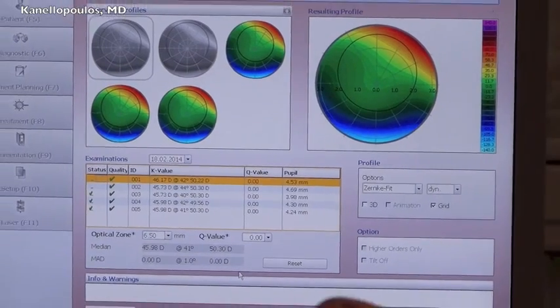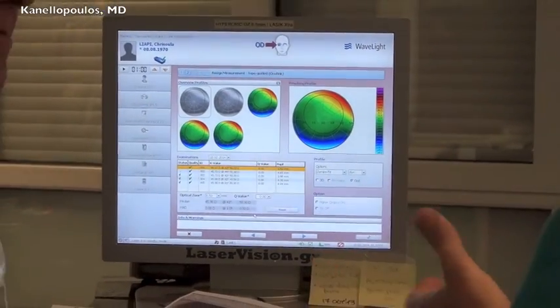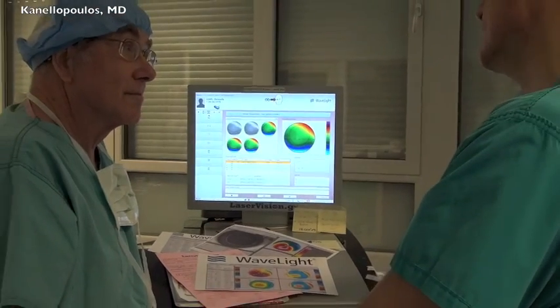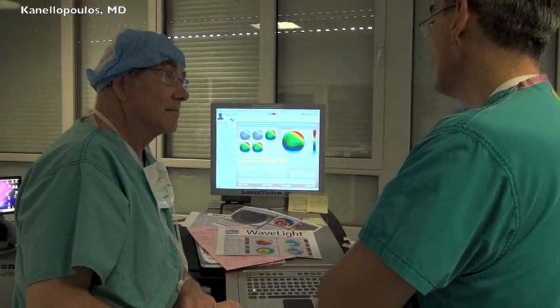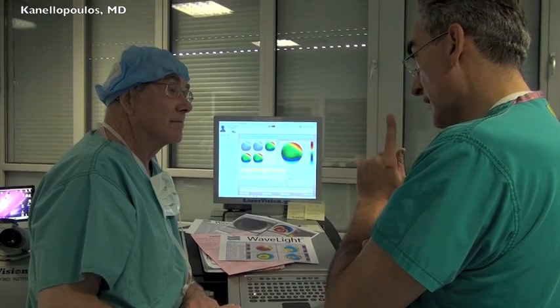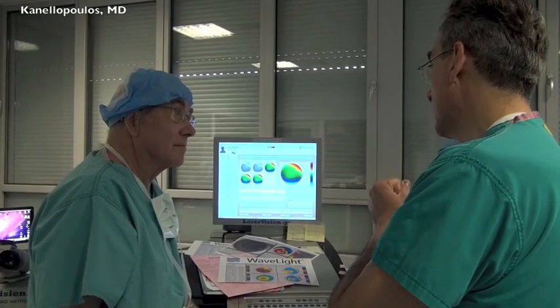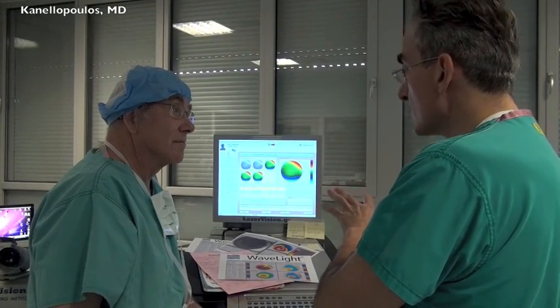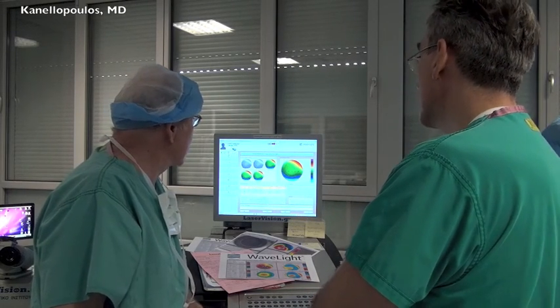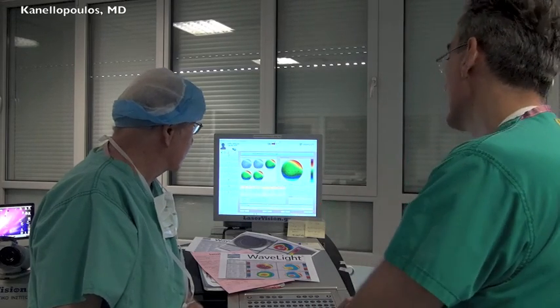I don't have an elegant way to prove why it might be better that way. It's mainly through experience, but it's definitely worth looking into. We have traditionally tried not to be left with just 1 or 2 Pentacams, to have more than 2, and have a reasonably small deviation between them. But that's a considerable argument to have the average, because maybe the truth lies between the average of them.